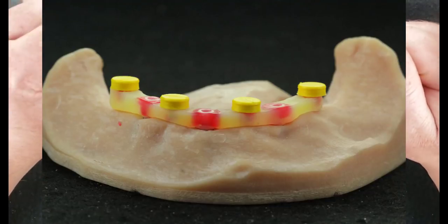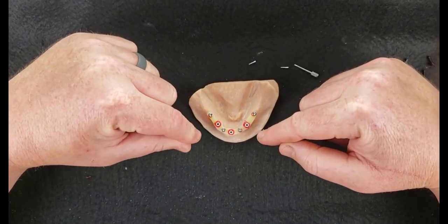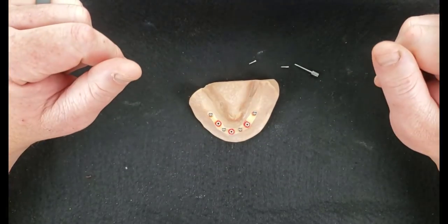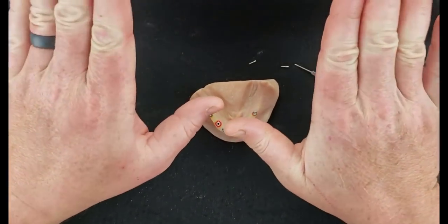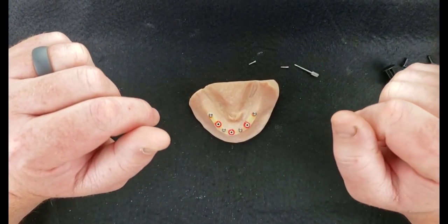So this will be a far more stable denture than what would have been able to be achieved if you had just done 3 individual locators. That denture still would have had a lot of anterior posterior rock, and you would have worn through attachments at a far greater rate too.